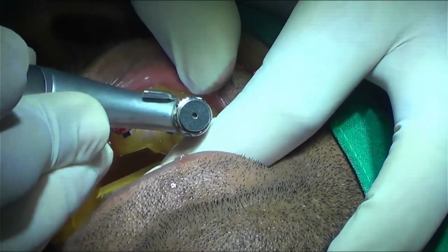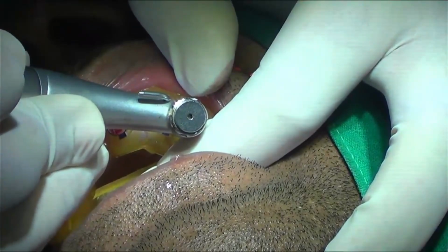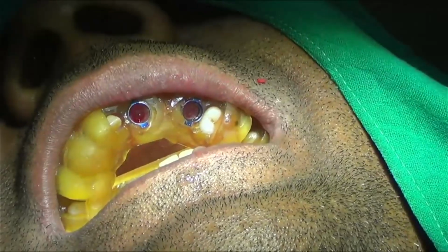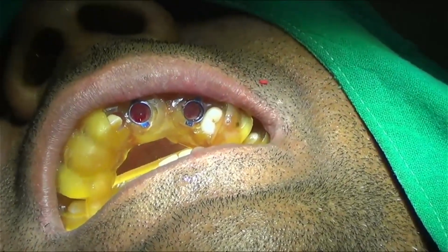I'm done till the bottom of my first black mark. Once this is done, just keep it here.